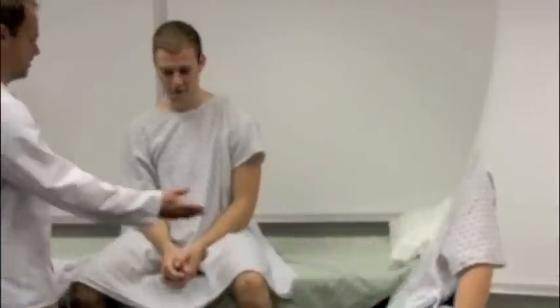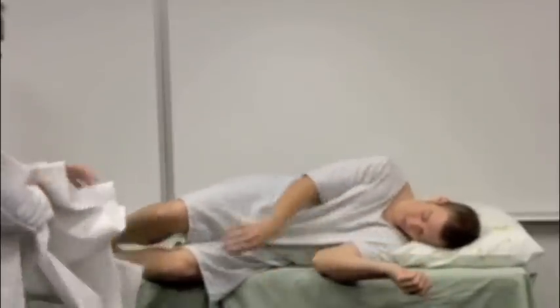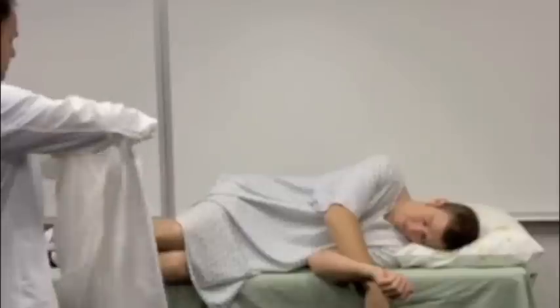Next, to better assess the apex of the heart, have the patient lay on his left side. This may be necessary with obese patients.